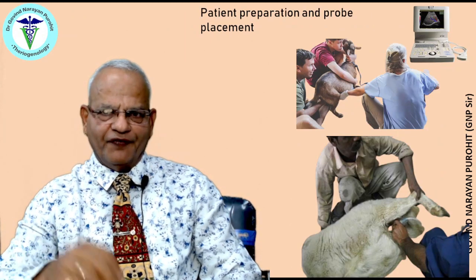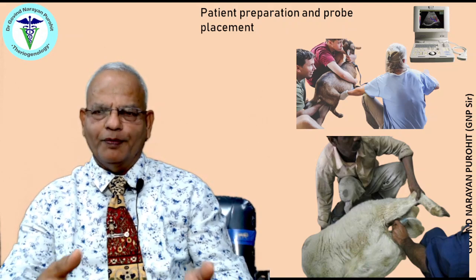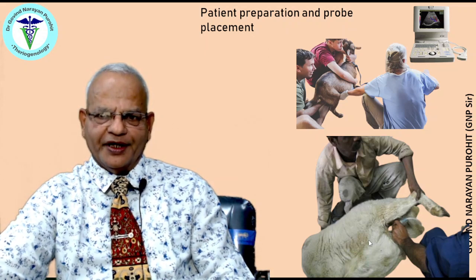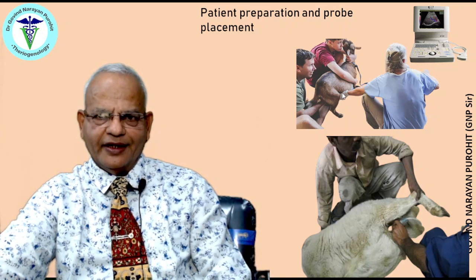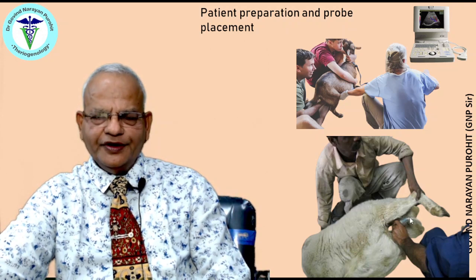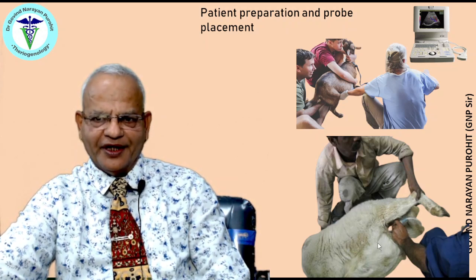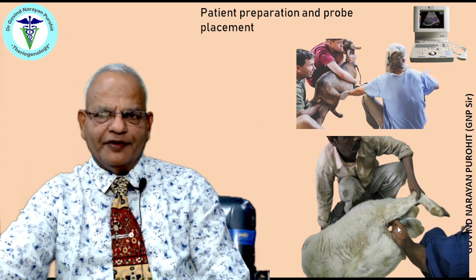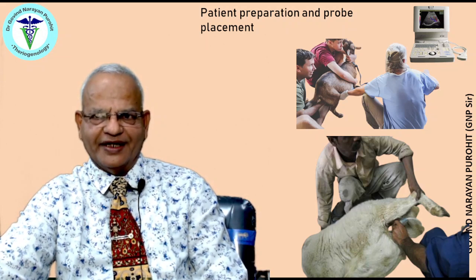The first thing for ultrasound examination is patient preparation and probe placement. One can examine both sheep and goat in a recumbent position or even in a standing position. The probe is placed between the limbs in a standing position, just ahead of the thighs and just ahead of the udder, and then one has to move the probe in a W fashion — from one side, back, across, and back again — to ensure both sides of the abdomen are examined.